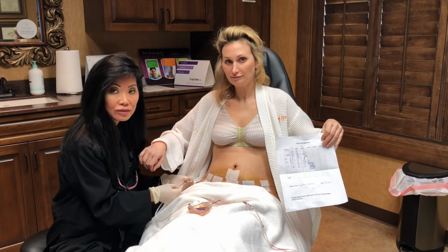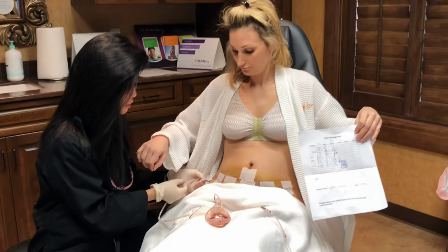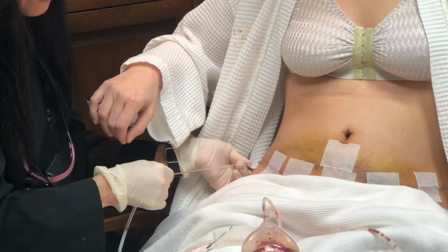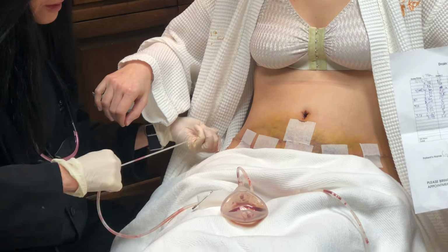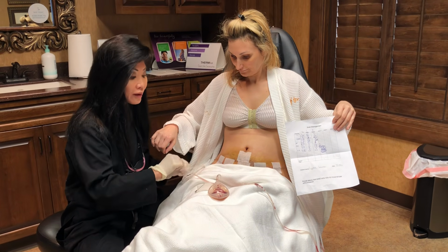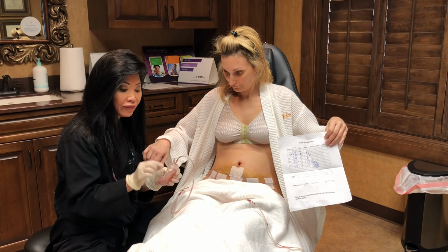When we're taking care of the drains, we like to strip the drains, and you may want to strip the drains every couple hours while you're awake. And when we strip the drains, what we do is we hold on to the drain, and then we take our other finger and thumb and just squeeze and come down. And then we bring the fingers down and squeeze and come down. So what it's doing is suctioning fluid from the abdomen or the area that the drain is in into the bulb. It also keeps the drain tube open so it doesn't become clotted and stop up.